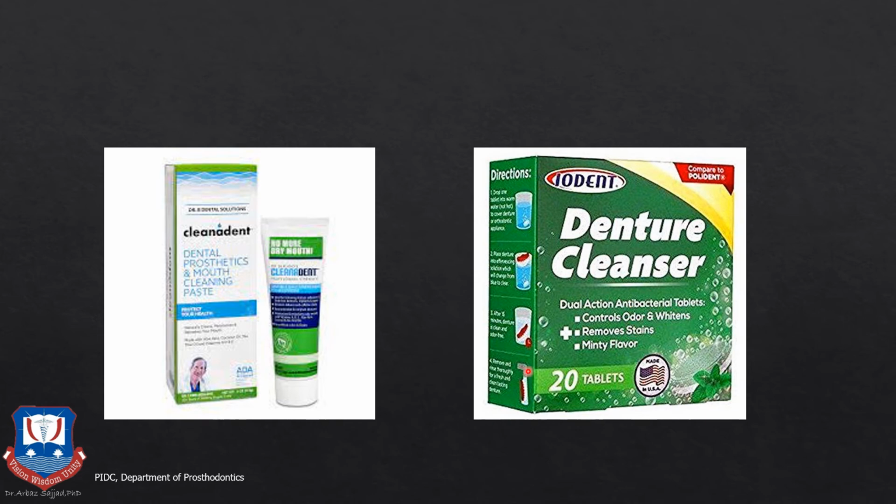So these are basically sodium perborate tablets. They create a highly alkaline environment, which kills all the bacteria and the viruses that may harbor on the patient's cast partial denture. In case these tablets are not available, the patient can also use vinegar and a tablespoon of baking soda for cleaning the dentures once a week.